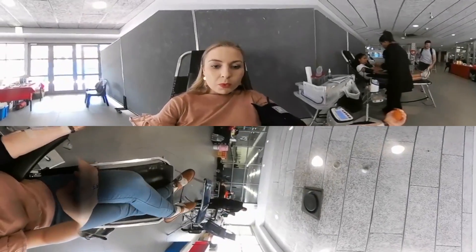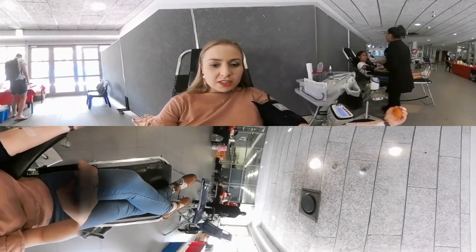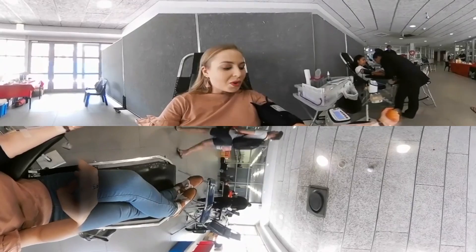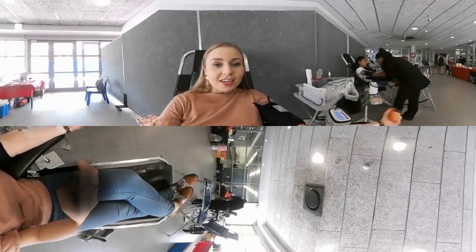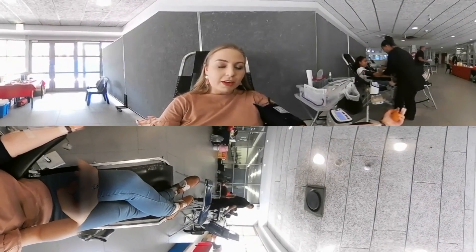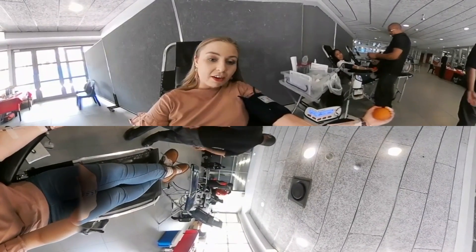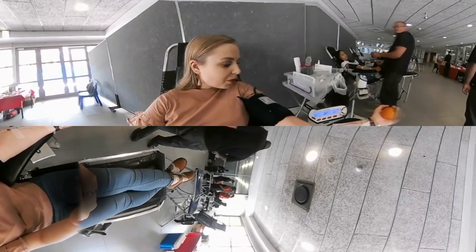I think I'm more than halfway done now and should be almost finished. I feel fine — I'll probably be a little thirsty and hungry later. It's going very well. I'm really happy I did it, especially now when they need blood. I've been going for eight minutes, but I'm an exception because I bleed slowly.